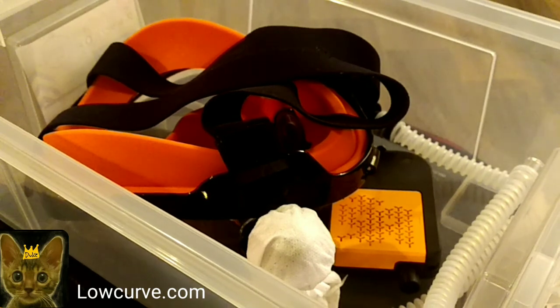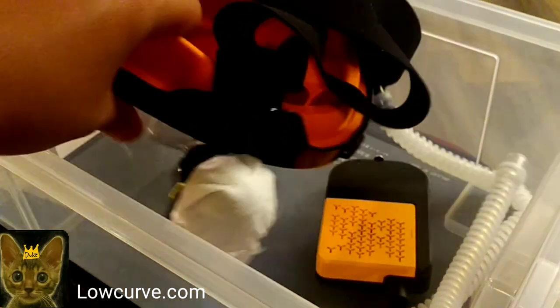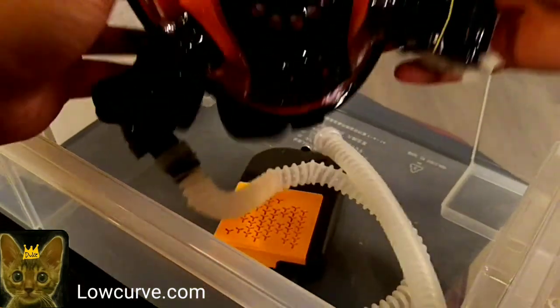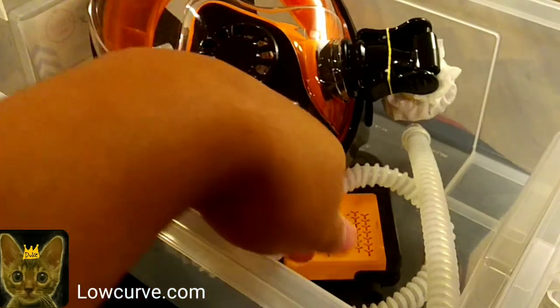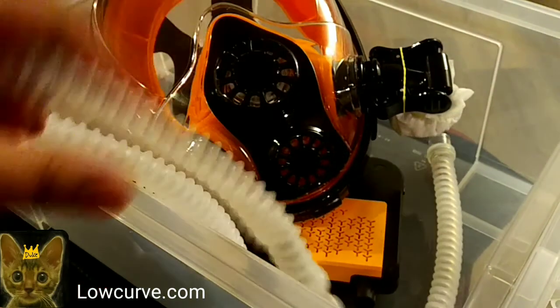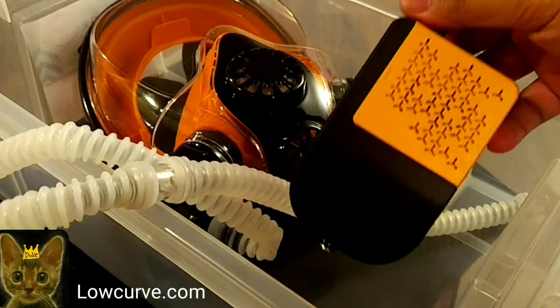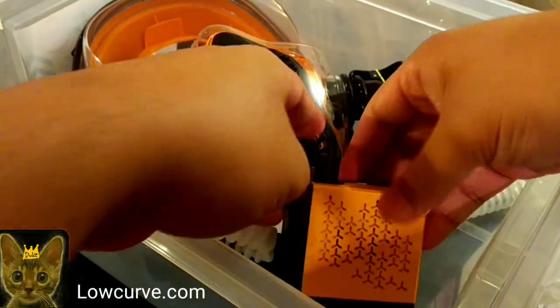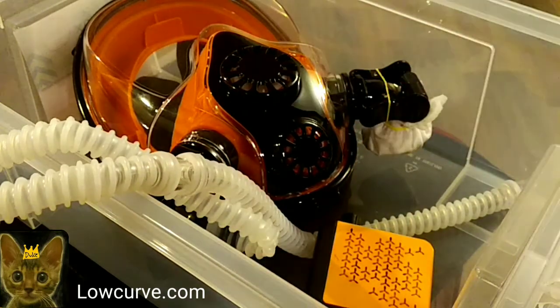I almost had it all in one take, but I totally forgot one of the most important aspects of this concept, which is the original iteration. This is something I built for my Uncle Johnny, who has experienced some health issues in recent years. And so I got him this thing off the internet thanks to stupid Facebook ads, and I adapted it to a different type of snorkel mask to give him full protection.